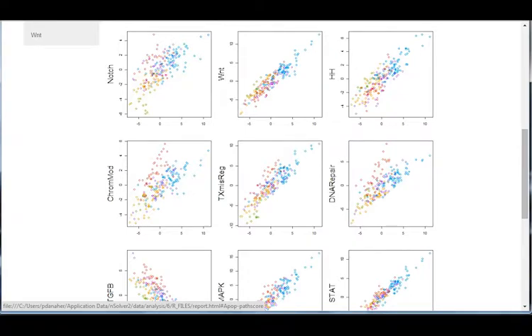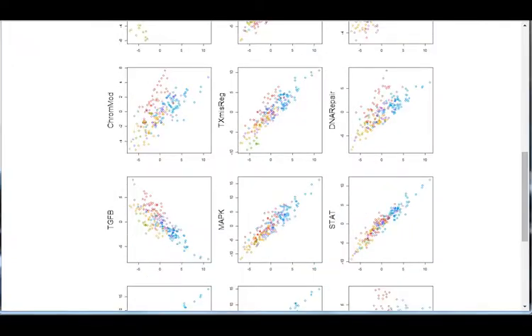We might speculate that these two subtypes take advantage of different oncogenic pathways to grow and survive. The apoptosis pathway's relationship with the TGF-beta pathway score is also interesting. The scores are highly correlated, but the odd behavior of the normal samples in the TGF-beta pathway seems to have reversed the pathway score's direction.